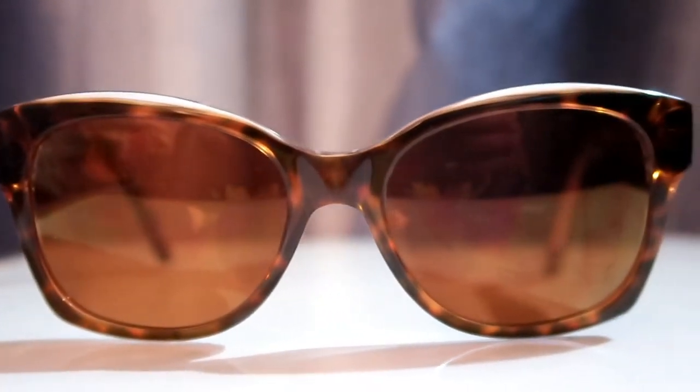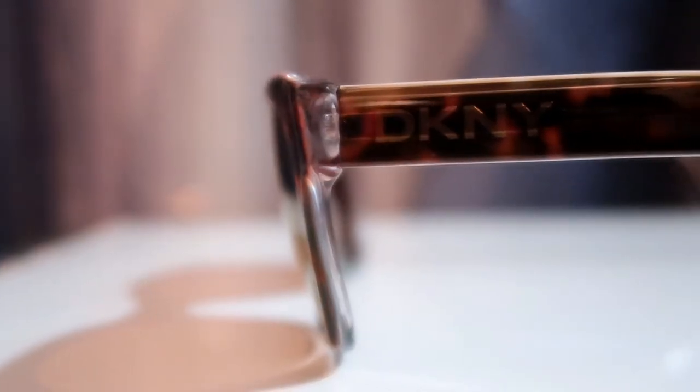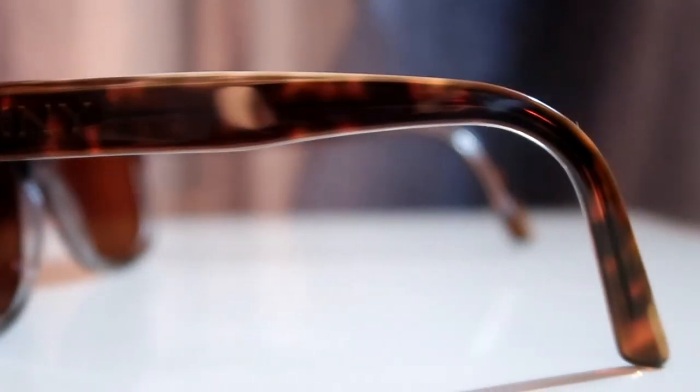I also wanted to show you my sunglasses, and these are from America's Best as well. They're a little dirty, but they are DKNY. They are polarized and brown, and they're also a tortoise frame with obviously plastic lenses. They are also high index lenses — Digimax ultra HD lenses with a golden mirror coating, so you can see the mirror coating there. I absolutely love these. They fit my face perfectly.